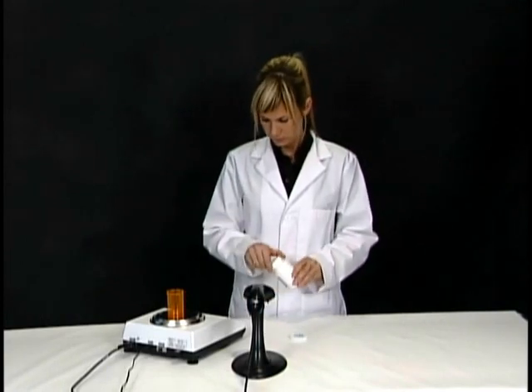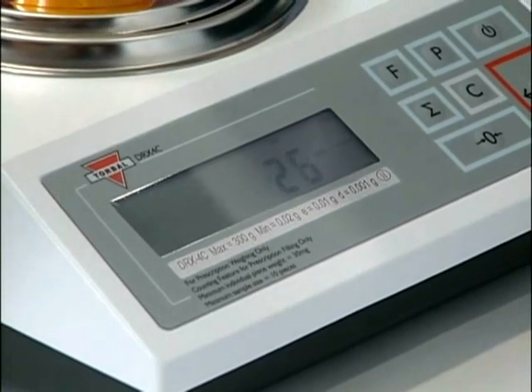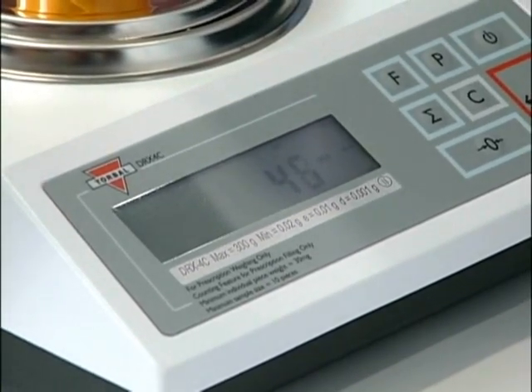Once the barcode is scanned, the scale indicates to begin filling the pills. Pills are counted as fast as they are poured into the vial.